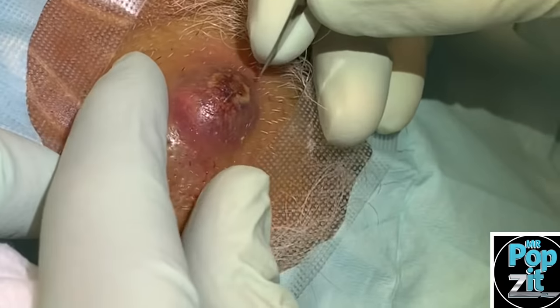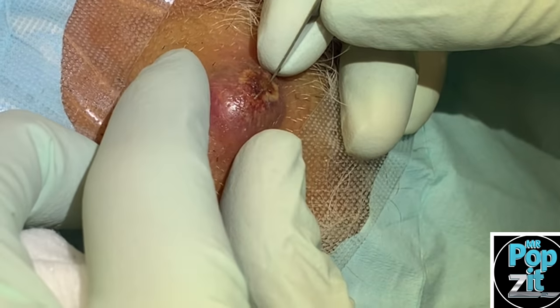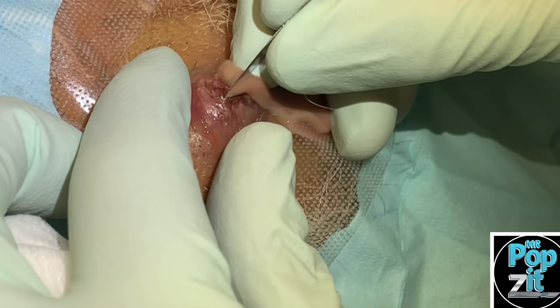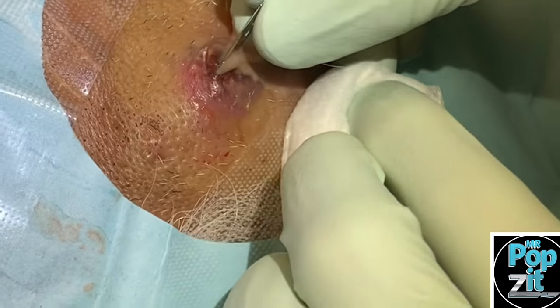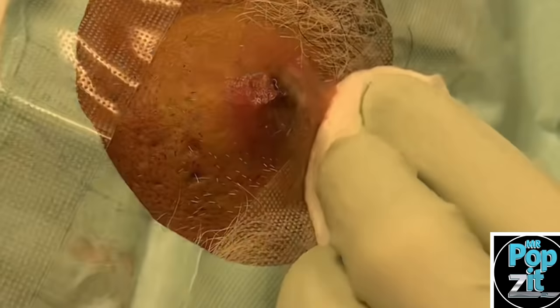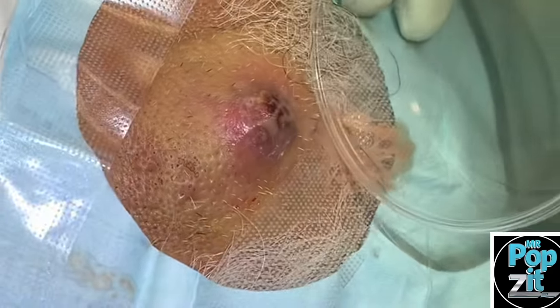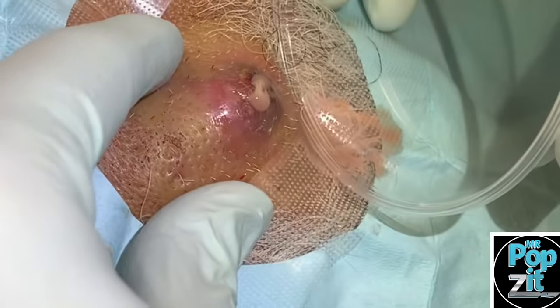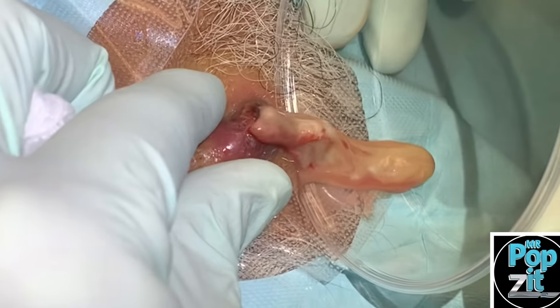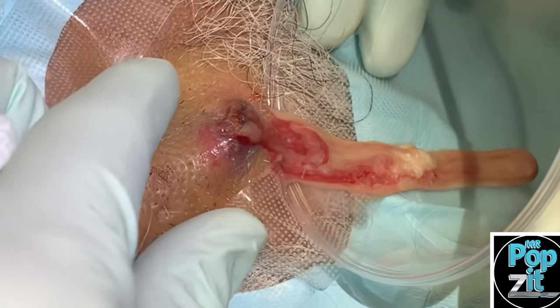Let me know if you feel any sting or pain. Good. So we're getting a pretty good chunk already there. A little bit of pressure here — there's some cyst particle. That's what I thought we'd get.